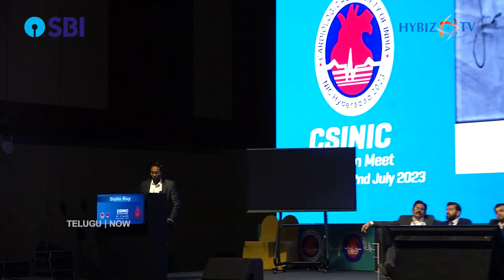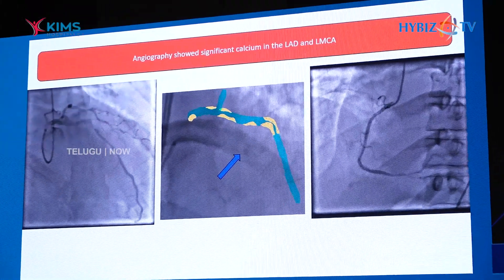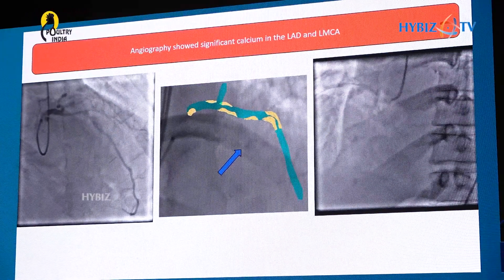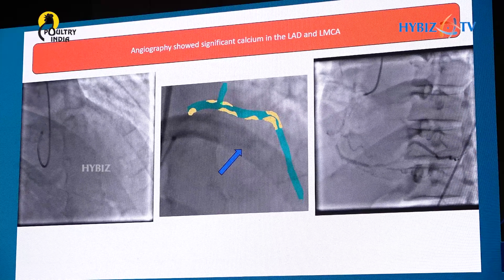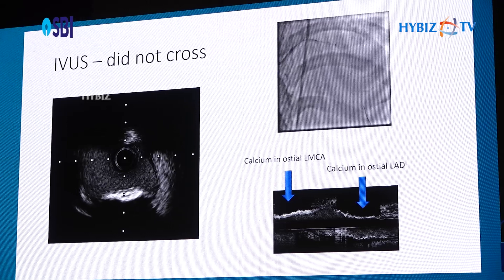The first case is a 74-year-old female who presented with non-ST elevation MI with heart failure with reduced ejection fraction. The angiogram shows a nodule sitting at the ostium of the LMCA and a heavily calcified LAD with a critical stenosis at the mid-LAD just at the bend. The fluoroscopic image confirms a very tight calcific lesion across the bend. For these lesions, rotational atherectomy carries a very high risk of the bur getting stuck, so the ideal modality is orbital atherectomy.